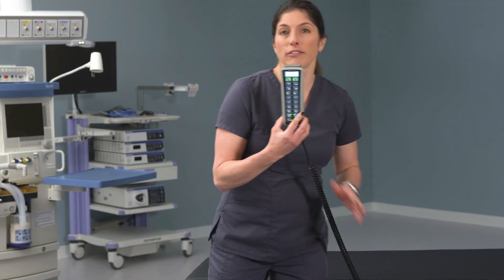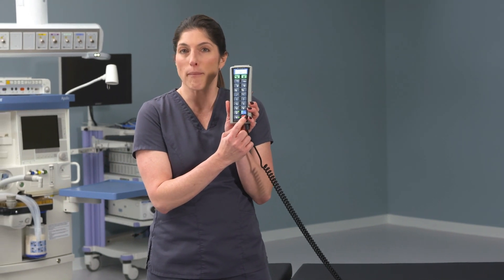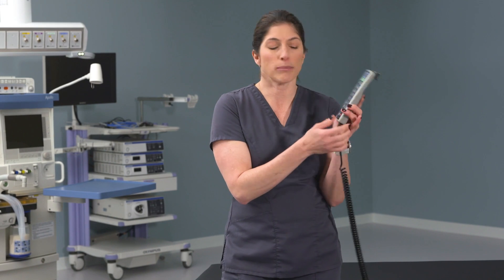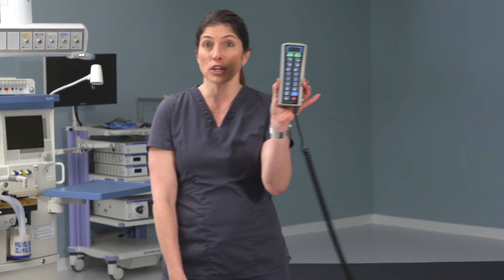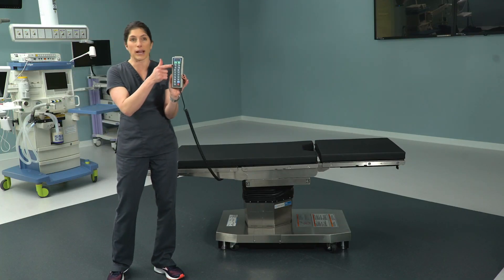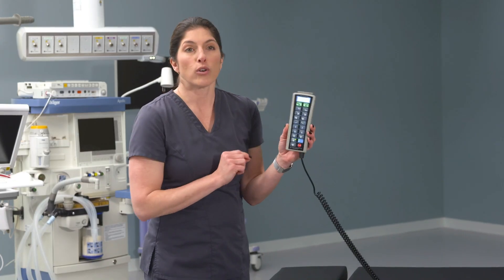Another small nuance of the 5085 that's different from the 3085 is the stop button. The stop button will stop the table movement in an emergency, but it's also the off button for the hand control, so you can turn it off. Important to know: if you ever see anesthesia not knowing how to turn the hand control on, any button other than stop will turn that hand control back on.